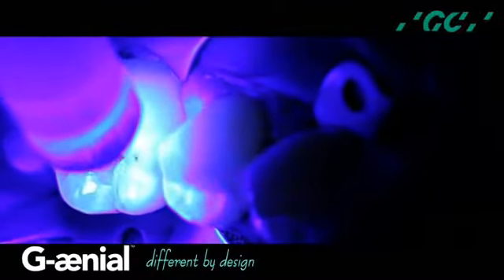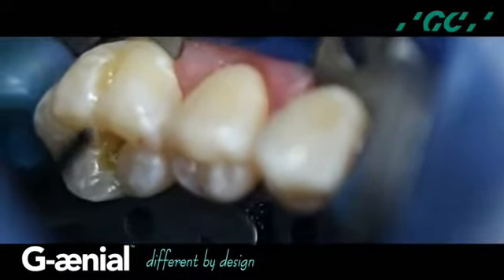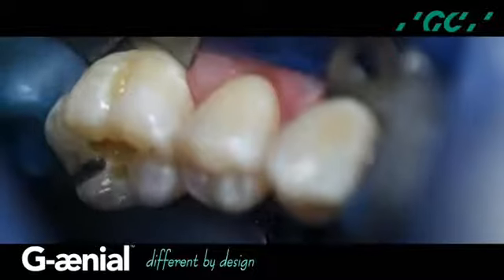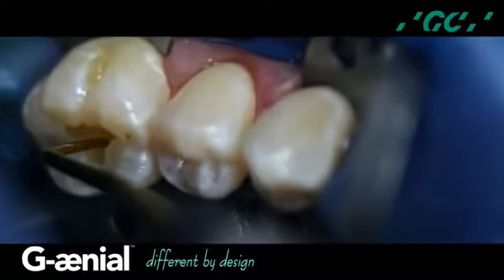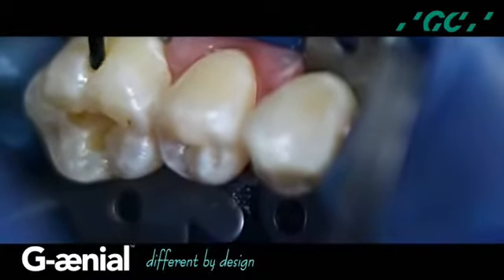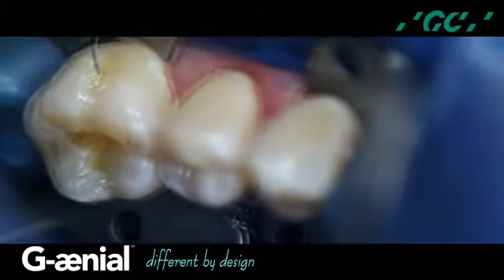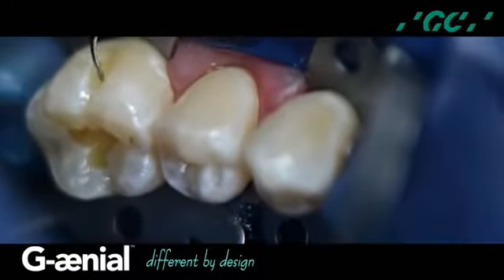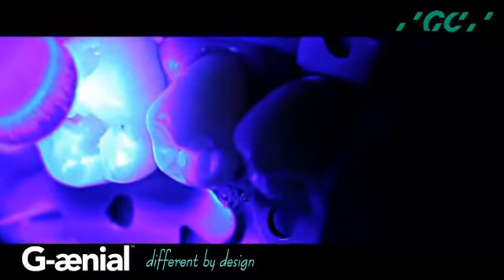An initial thin layer of A3 shaded G-aenial universal flow is applied to the pulpal floor and adapted using a round-tipped instrument, an M1 by American Eagle. Also, a thin layer of A3 shaded G-aenial universal flow is applied to the axial wall of the buccal preparation and adapted to the cavity walls using an 1112 Explorer by Ufridi and light cured for 10 seconds.